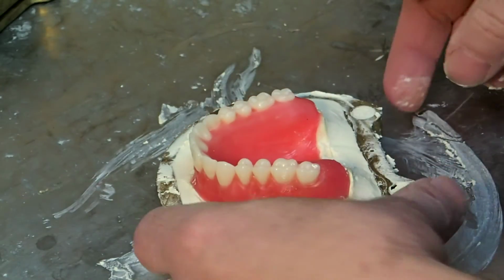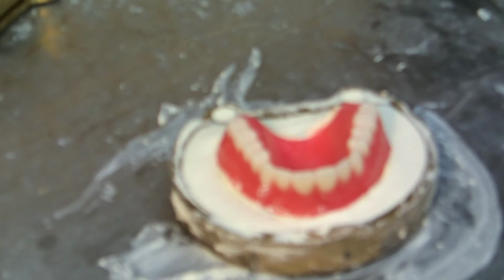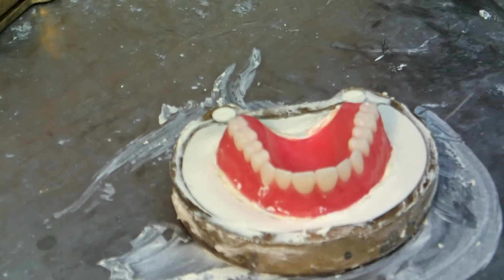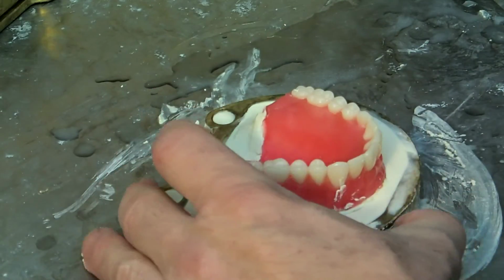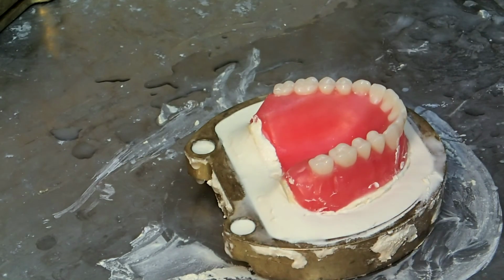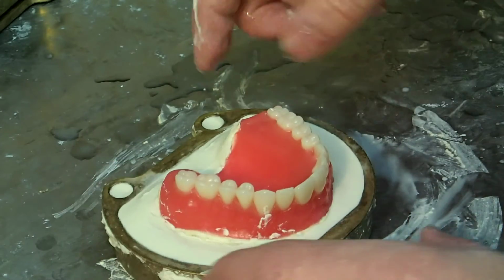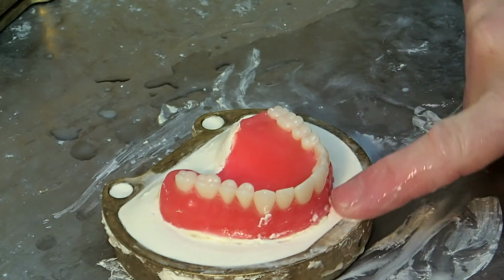So I'm going to let this stiffen up, go to an initial set, and then I can just smooth it with my finger. That's all you need to do, is let it stiffen a little, put some water on your finger, and then with a wet finger I can smooth the stone right out. And I can also clean off the brass of the flask. The brass has to be completely clean. I want to see these nice straight lines at the front and the back of the flask. You have to see that nice straight line across there. If you've got any little waviness to it, that means that there's stone over the flask.